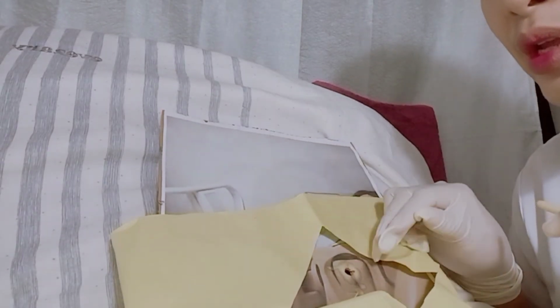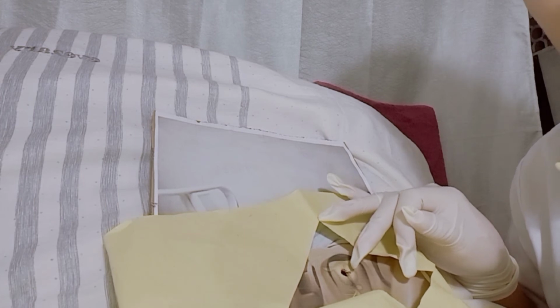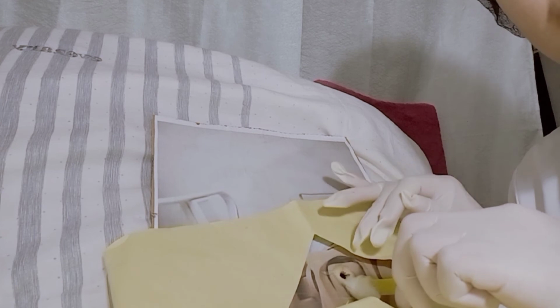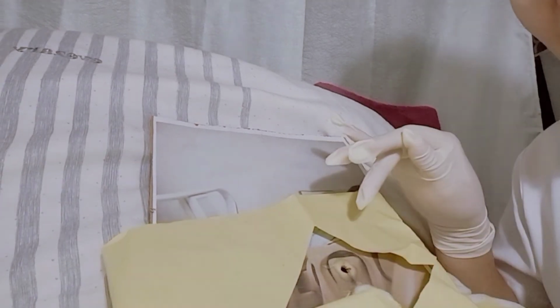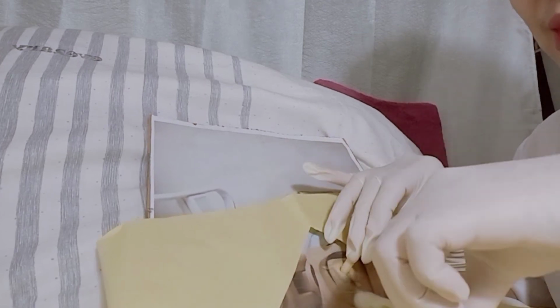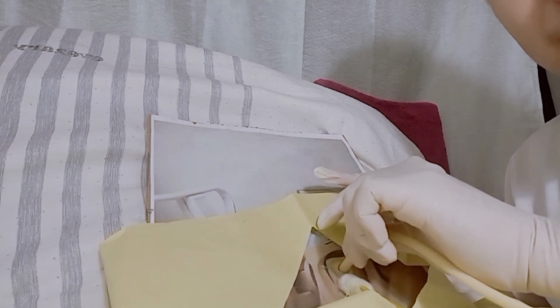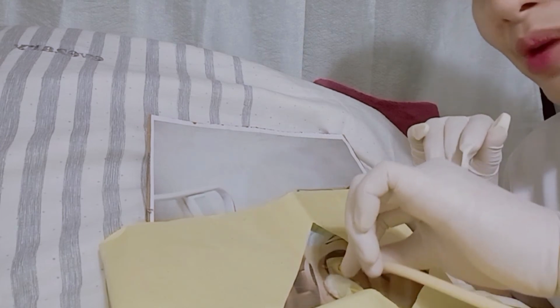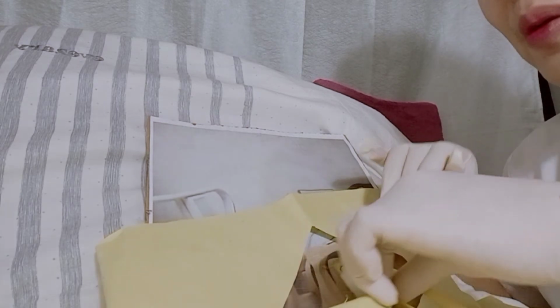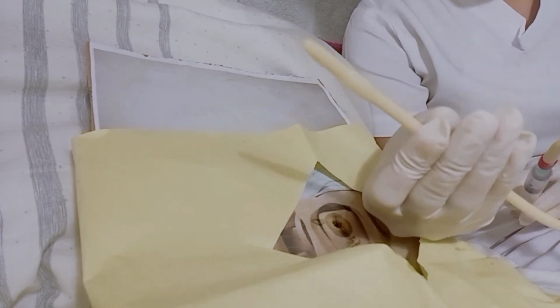When things don't work out and you can't find the urethra, always remember that it is below the clitoris area. You can use this stick to pinpoint the area before inserting the catheter into your patient's urethra. Then when you see urine backflow, it means you have inserted the catheter correctly. Yes, it's working.